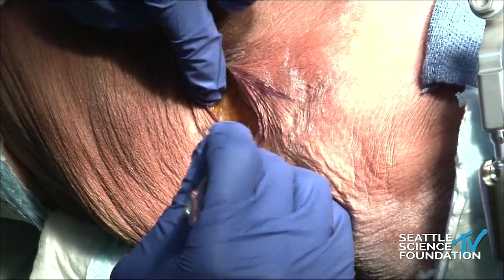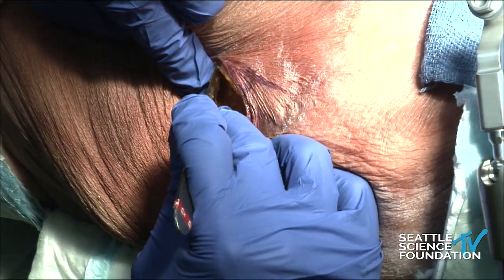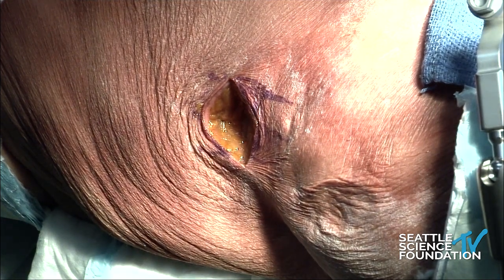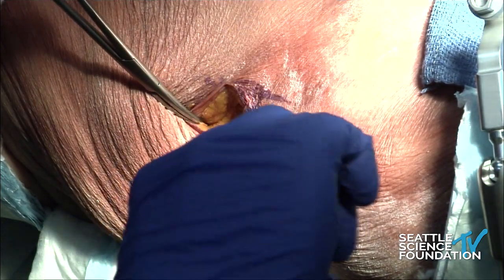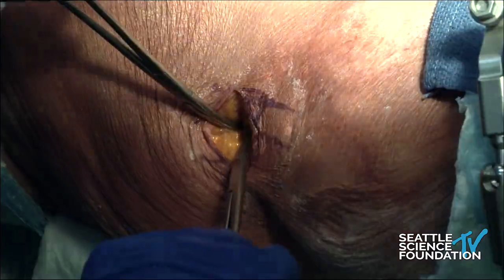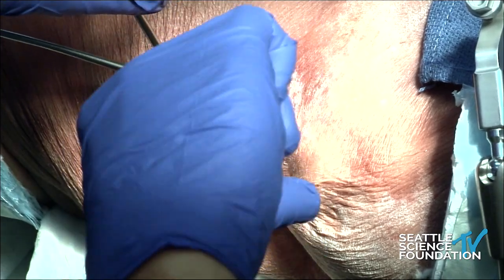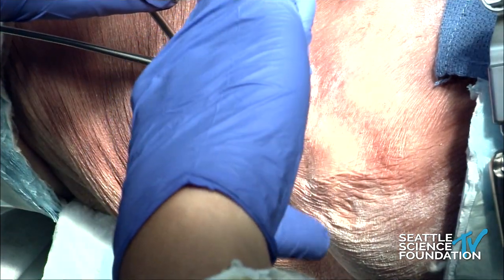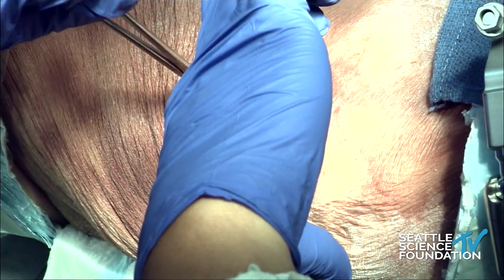Since we're in a cadaver, we'll just go down sharply for the sake of time. We're getting down to the muscle layer where we're going to identify the external oblique. We'll bluntly dissect — the lighting isn't the best, so basically we're looking for the muscle fibers. We'll divide here, and at some point you'll see the fibers cross — then you know you're in the internal oblique. You can see the fibers there.